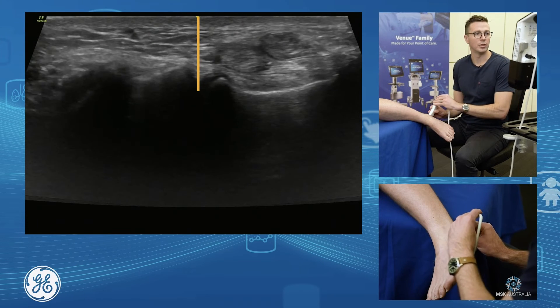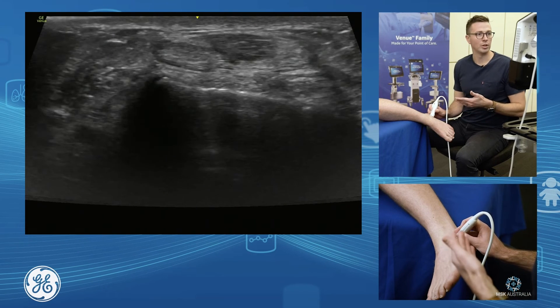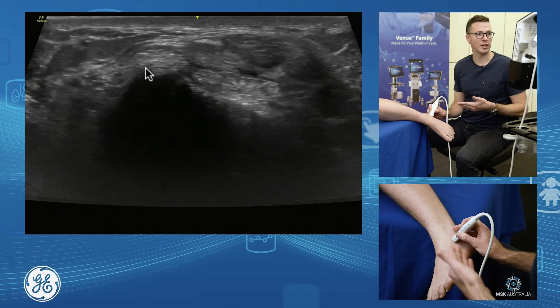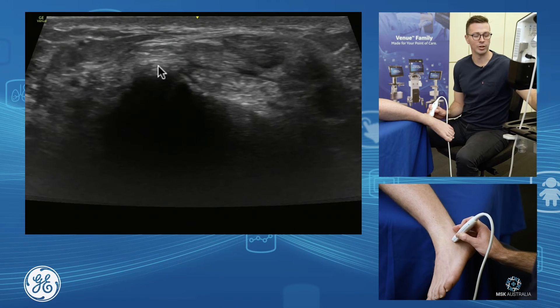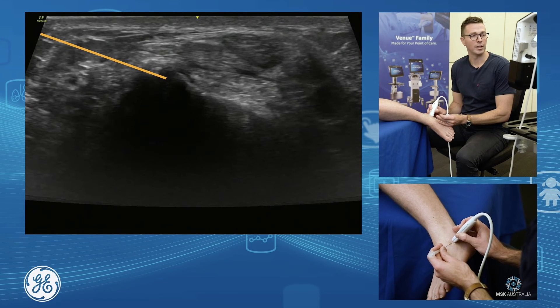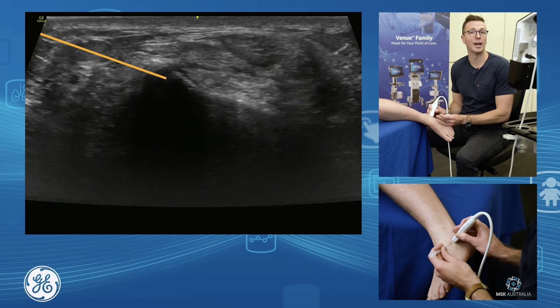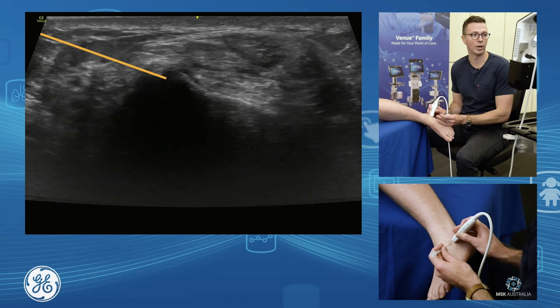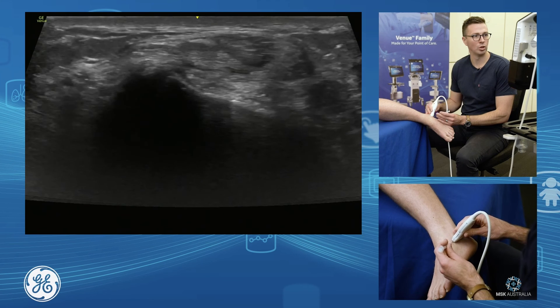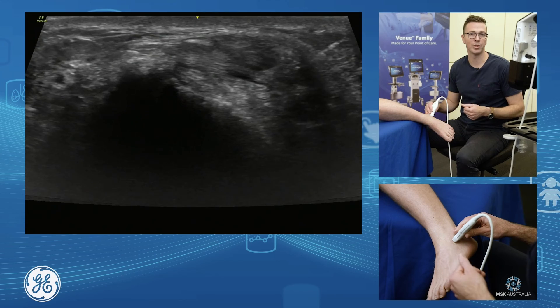Or you can bring your probe around longitudinally. Going longitudinal, we find our calcaneus and our talus — here is the very front of our subtalar joint. We can bring our needle down and in through here, hit the front of that calcaneus, and it will flow into your subtalar joint. You can hit your sinus tarsi and subtalar joint all in one go — dropping down in short axis or long axis. A nice way to go about interventional techniques of the ankle and subtalar joint.